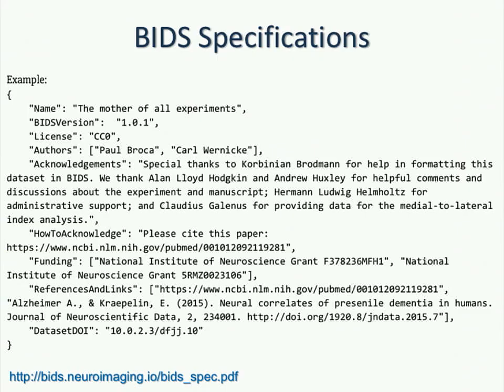Can I ask how many people are actually using the BIDS format for their dataset? Not that many of you. So I think it's worth having a high-level description of how these BIDS datasets are formed, right? Yep. And you're going to see that more in that course.